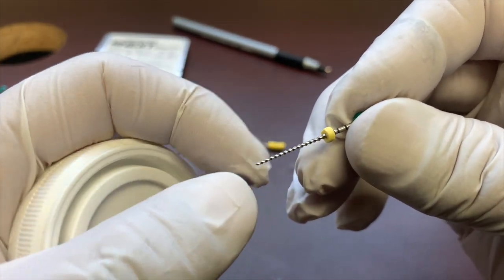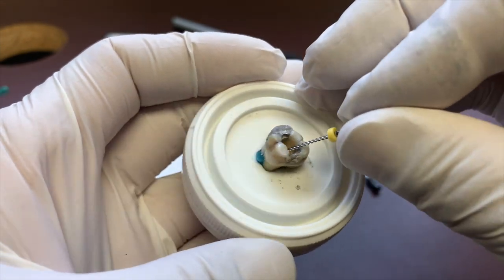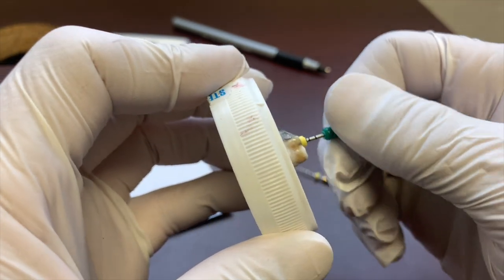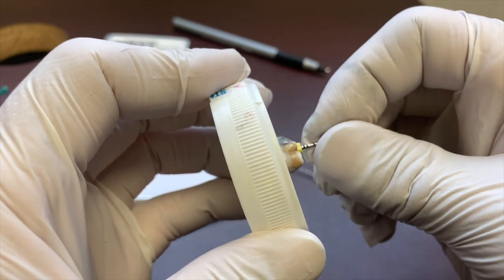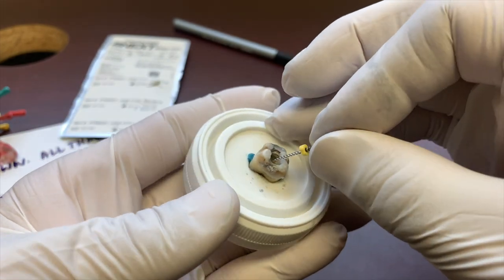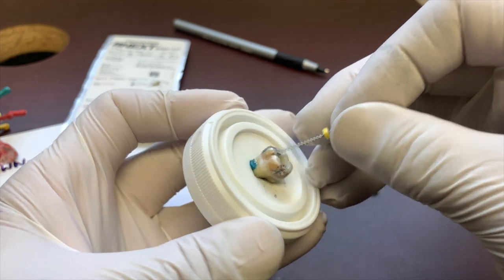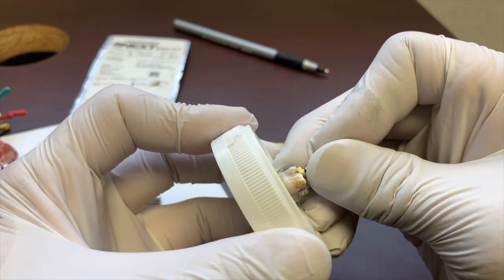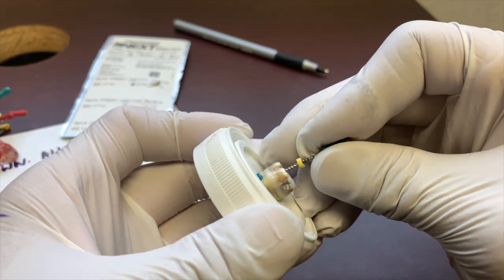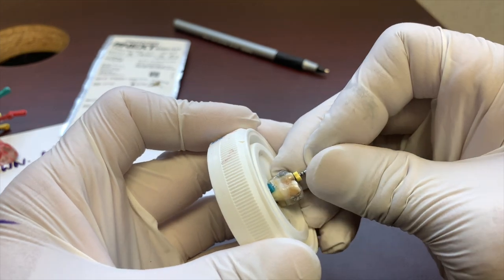Sometimes you get debris on the flutes of these large files, sometimes I don't. So we're gonna do one more cycle. You're gonna be irrigating the whole time. Lots of irrigation. And just a tiny little debris. As I'm making my way apically, I'm gonna slowly do some filing. I'm gonna pull back, get slowly to my working length, and file coronally. You can also use a balanced force technique in and then pull. There's a whole bunch of different ways you can do this.